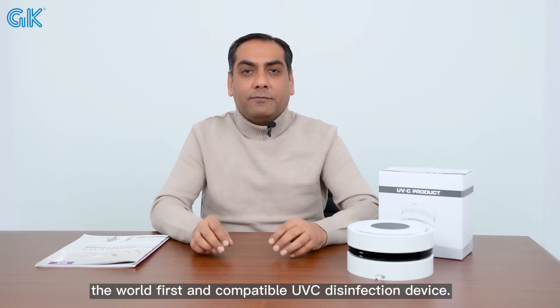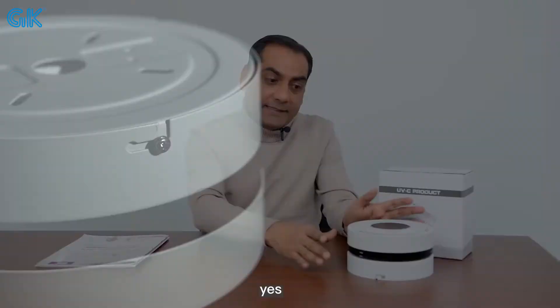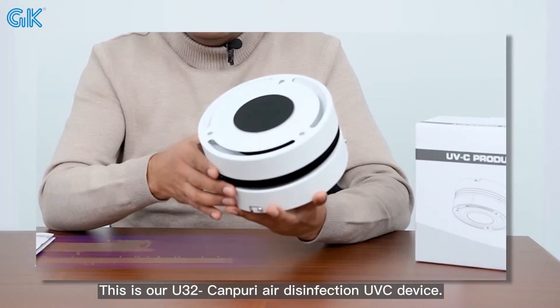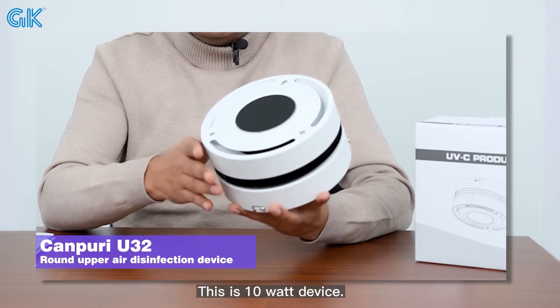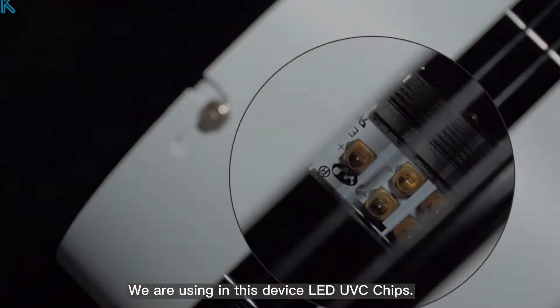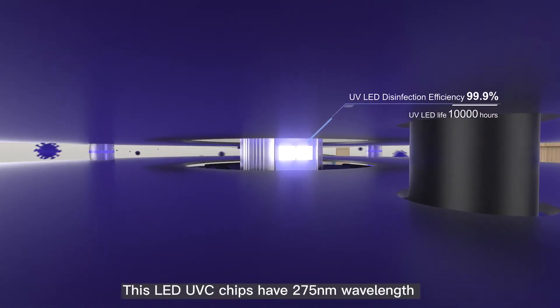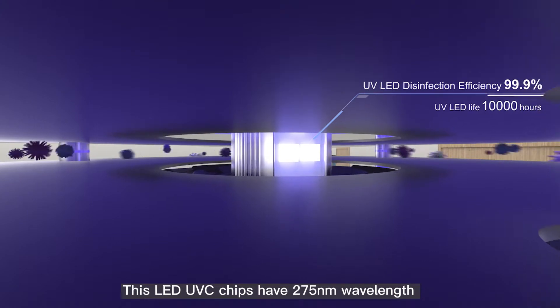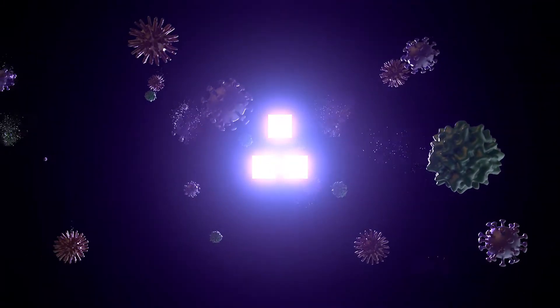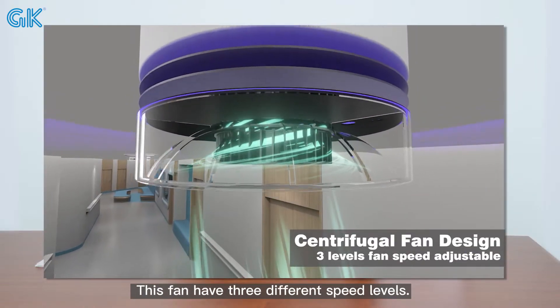Today I will show you the world's first compact UVC disinfection device. This is our U32 Canpuri air disinfection UVC device. This is a 10-watt device using UV LED chips with 275nm wavelength and 10,000-hour lifespan.